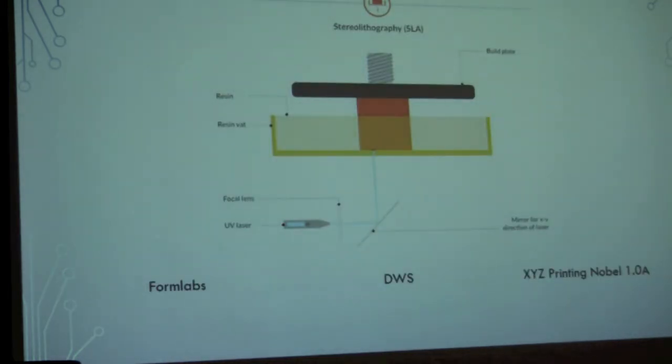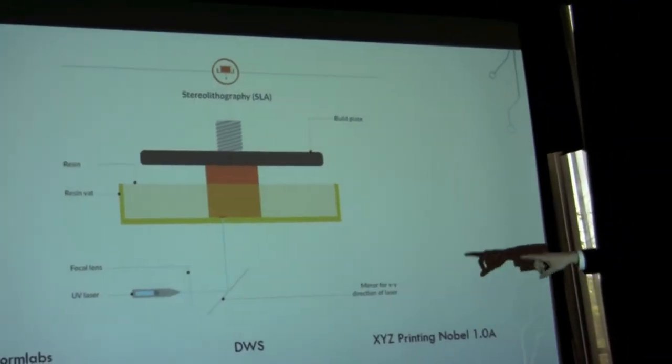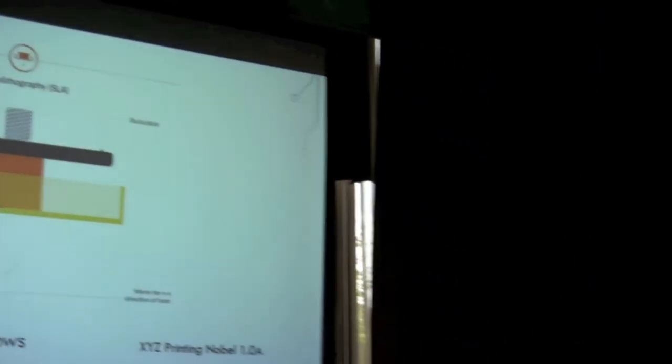So the most common first form of 3D printing for stereolithography is stereolithography laser. So you can see here, all the printers, they have a light engine. For this one, it'd be a UV laser that's going to shine up, and it's going to cure every layer that needs to be cured to be able to create the object. So the downfall of this type of printing is that it takes a long time. We have to draw every slice, every section of that model to be printed.